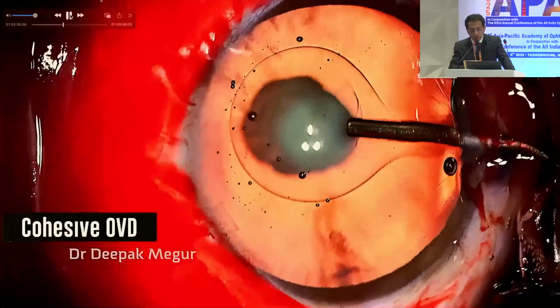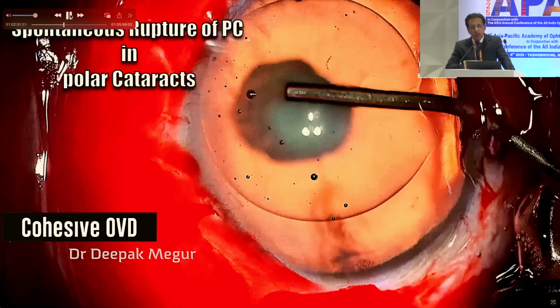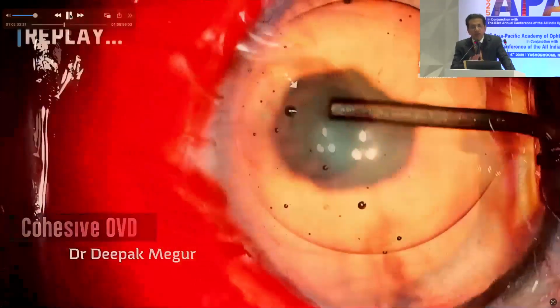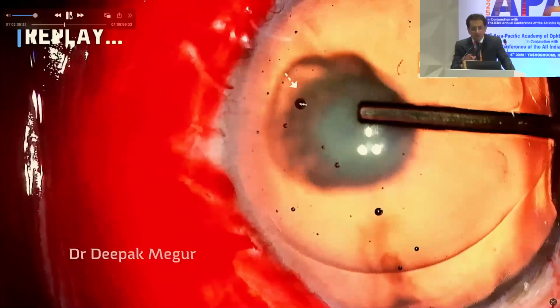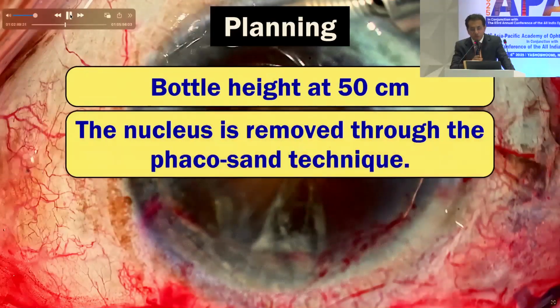Here is another point: we don't want a very high hydrostatic pressure. If you keep an AC maintainer and keep the bottle at 90 centimeters, you are going to blow out the capsule. The function of the AC maintainer at this stage is just to ensure that the chamber does not collapse, so it is kept at 40 or 50 centimeters. If you overfill, you are going to blow out the chamber. So you don't want that.